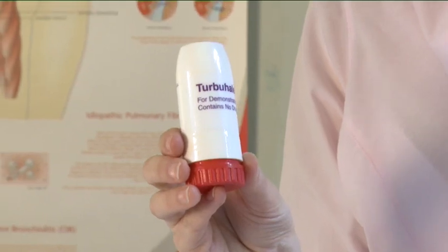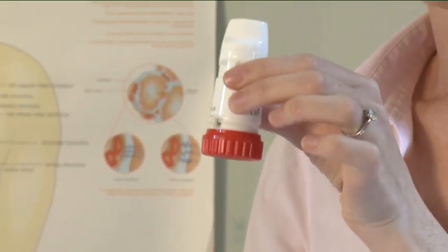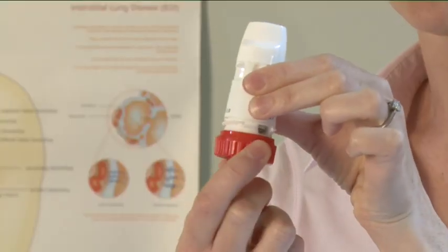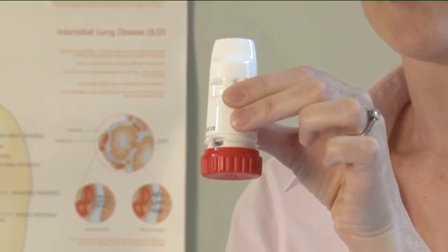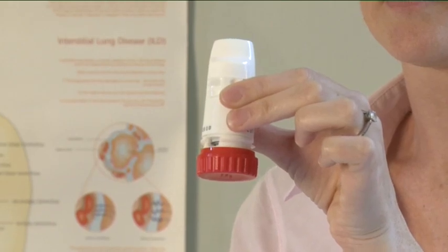To take an inhalation, unscrew the cover and lift it off. You may hear a rattling sound. Hold your Turbohaler upright with the red grip at the bottom. Do not hold the mouthpiece when you load your Turbohaler. To load your Turbohaler with a dose, turn the red grip as far as it will go in one direction, then turn it as far as it will go in the other direction. It does not matter which way you turn it first.